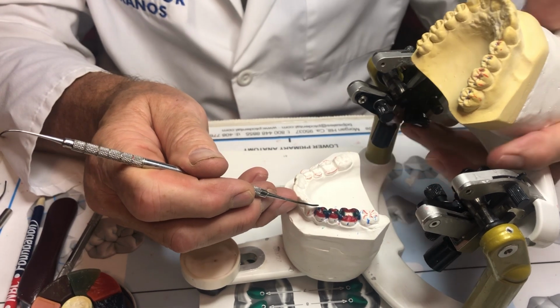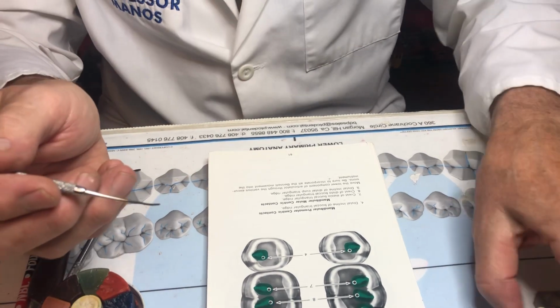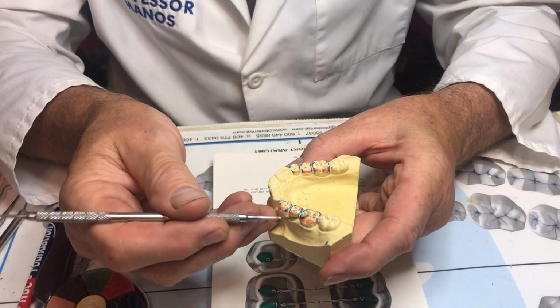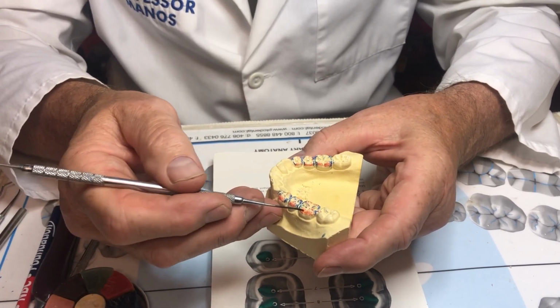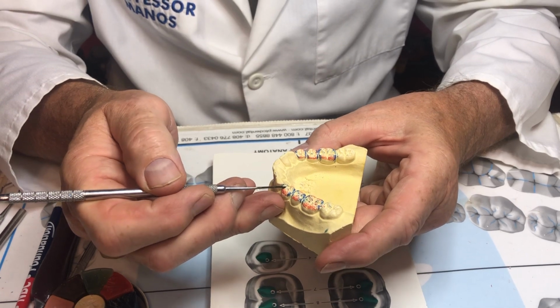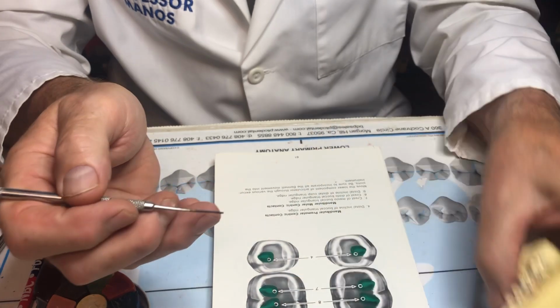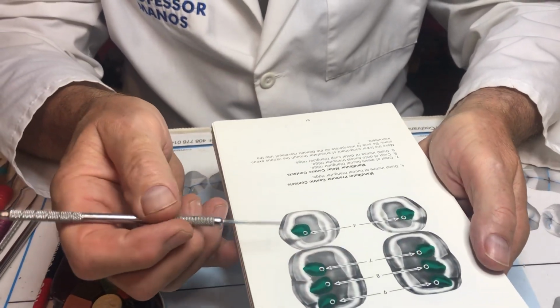So before we do that, let me go back to the book. And remember, before you do anything, stop and look at what you're trying to accomplish. Remember, this is the master model. If your final wax up looks like this, you wind up with an A in lab. If your final wax up does not look like this, then you don't wind up with an A. So this model should be in front of you at all times. The book should be in front of you. The video should be in front of you. So let's look at what we're going to do now.